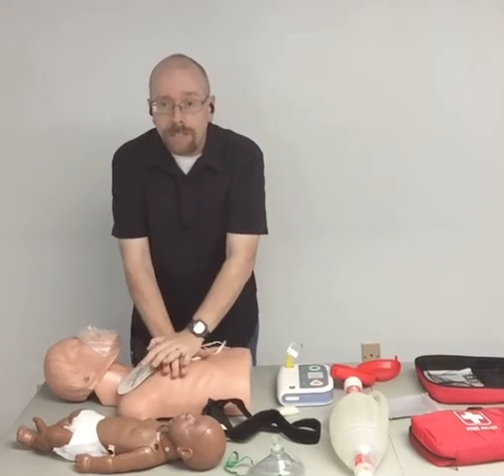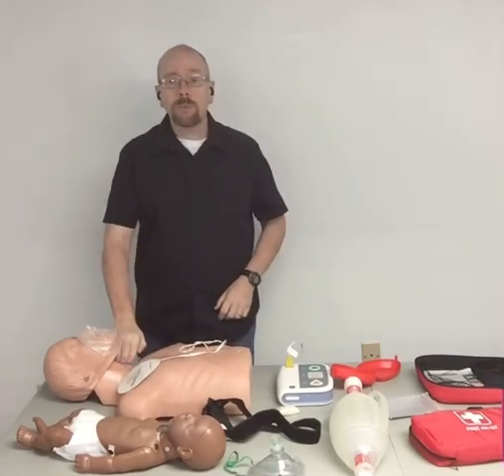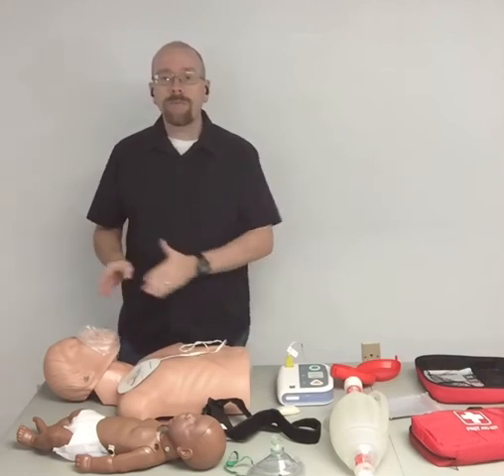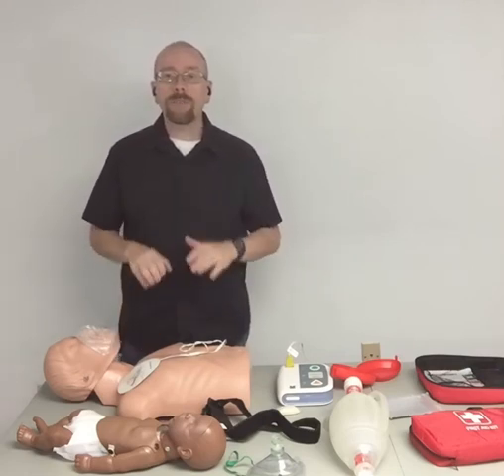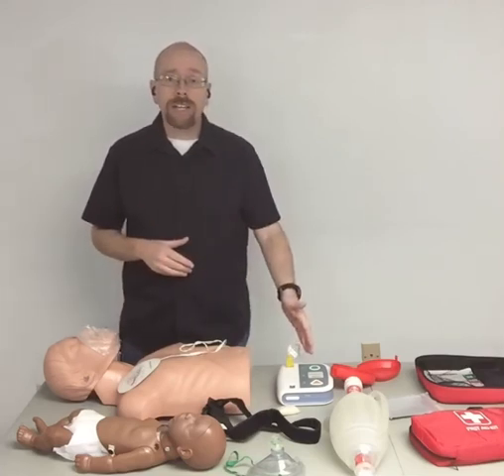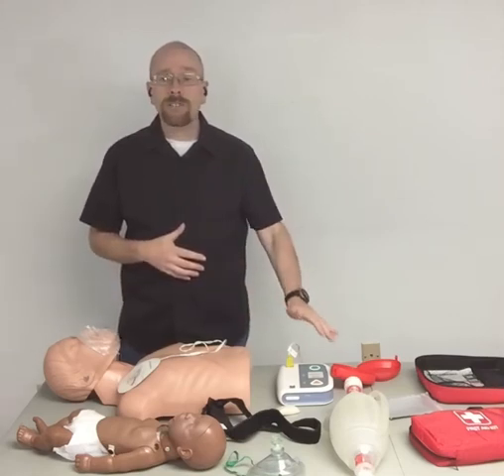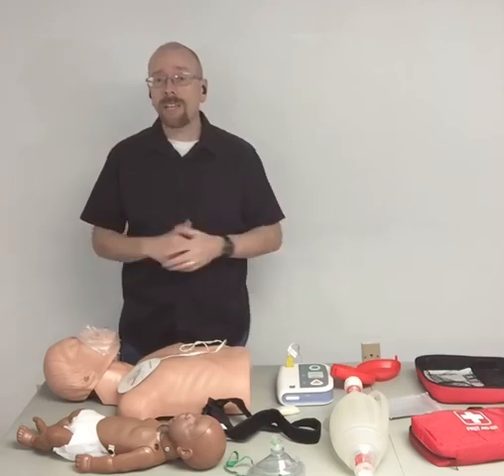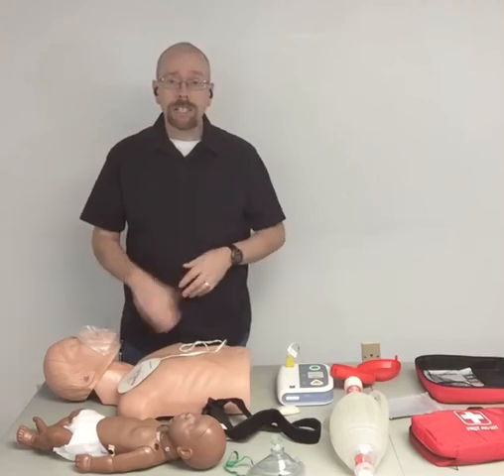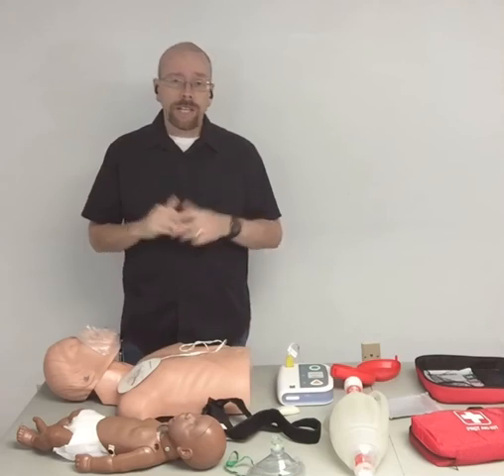So there are those times that the defib says no shock indicated. And if it says no shock indicated and the person is without a pulse, go back to CPR for another 2 minutes, either 30 to 2, 5 times in a row, or just 2 minutes of compression-only CPR. And in 2 minutes, this may reanalyze. It's still on, the pads are connected, it will reanalyze in 2 minutes, but it's probably still going to say no shock, unless for some reason the heart has started back up. But in most cases, when it says no shock indicated and there's no pulse, the outcome is not always that great. So that's how the defib works.